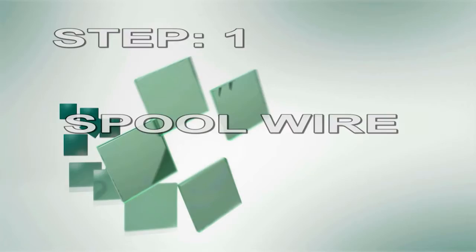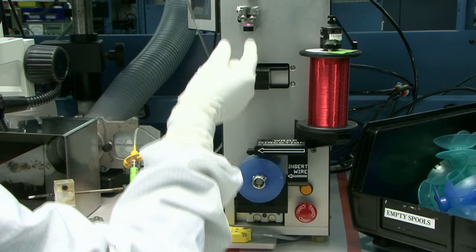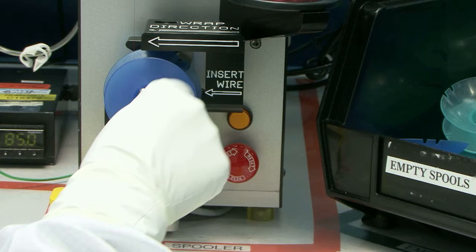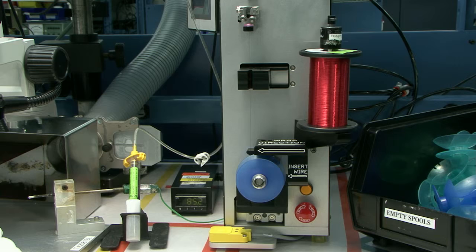Step 1. Spool wire. For our first step, slide one spool onto the spooling shaft and rotate until it clicks into place. Pull the wire taut and wrap it counter-clockwise around the spool. Then secure the wire, keeping it tight, into the spool notch, leaving one or two inches of wire extending out of the notch. Push the start button to start the spooling cycle.